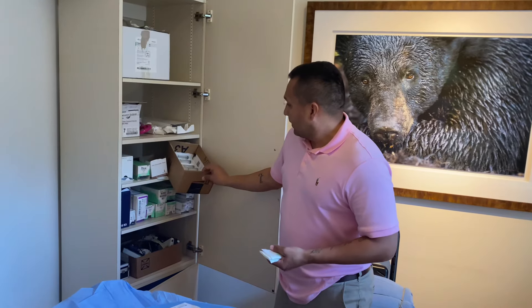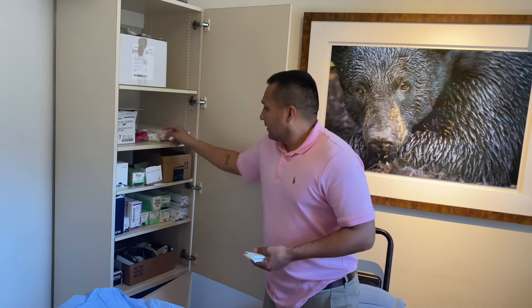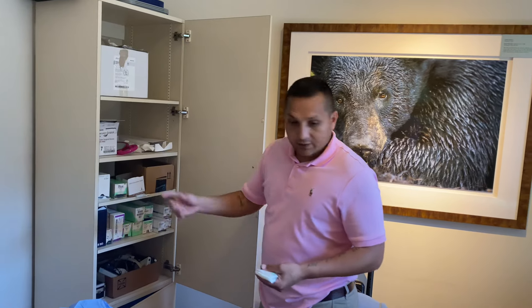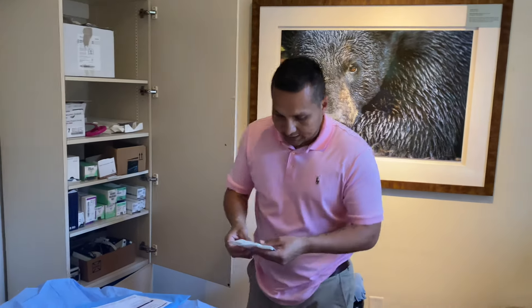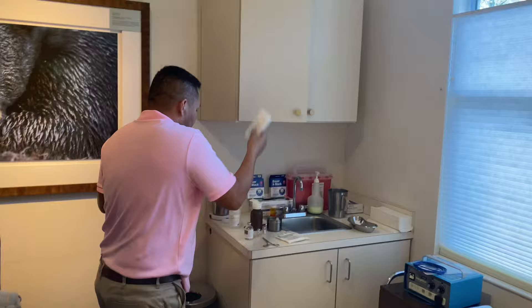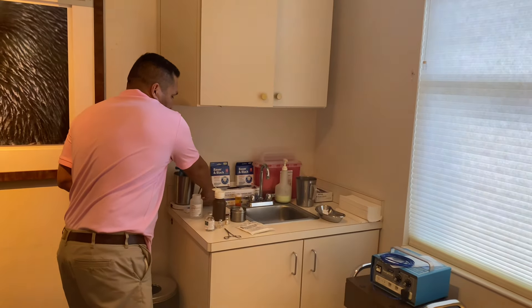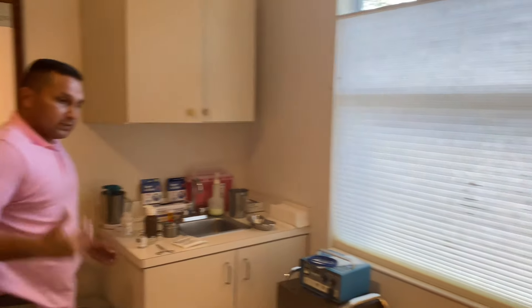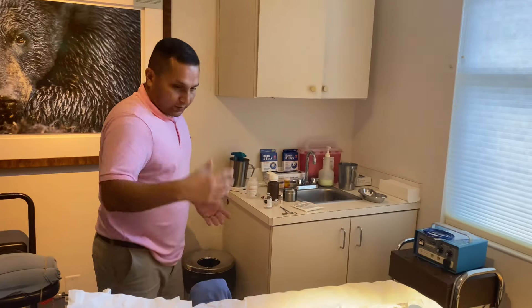The mirror and the size 7 gloves — we put those out later because sometimes Dr. Stein offers the patient the opportunity to look at the procedure if he wants. The 9-0 suture goes right here. Dr. Stein will ring the bell when he needs 9-0 or something else.